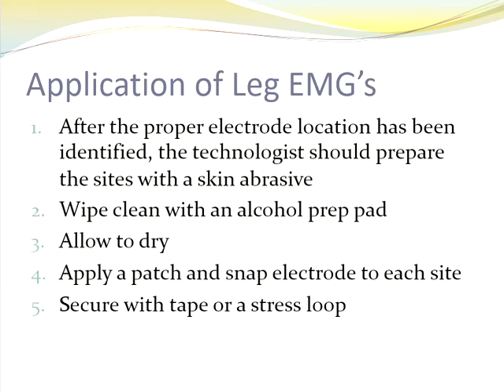Wipe it off. You can wipe it off with a clean dry gauze pad or an alcohol prep pad, so that the site is dry. Because again, it's tape, adhesive, stickers, they don't stick to wet skin. And then you're going to apply the patch with the electrode to each site. Again, don't forget our snap stickers work so much better when we add a little extra electrolyte to the center of the sticker, to that little gel area of the sticker. It pretty much rehydrates the stickers if they've dried out or anything like that.